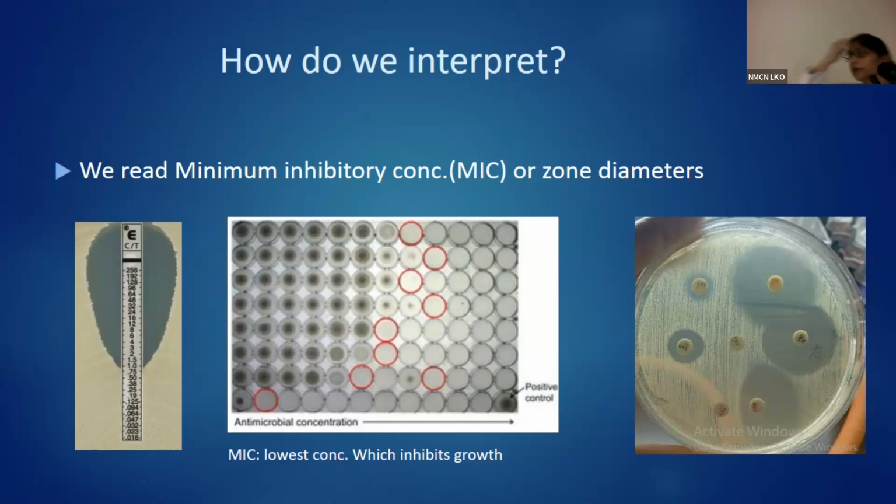Another thing, inducible resistance: we test for AmpC beta-lactamases also in certain gram-negative organisms like Pseudomonas. What we do is we put up an imipenem disc. Imipenem is a very good inducer of AmpC beta-lactamases. That means the AmpC which was repressed, not expressed in that pathogen, imipenem de-represses it, and the AmpC is induced. So imipenem also forms D zones with other beta-lactams. So if inducible resistance is there, that means if therapy is started with beta-lactams, the clinical response might be decreased, or it may even lead to clinical failure within the next 2-3 days of therapy. So we have to be cautious in that scenario.